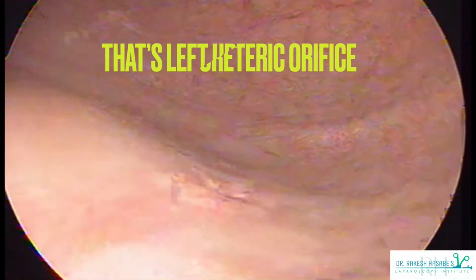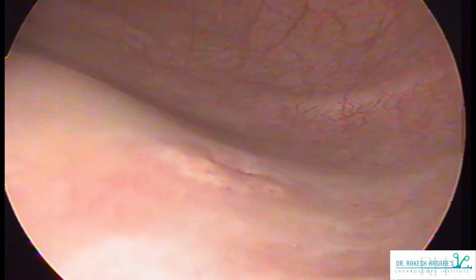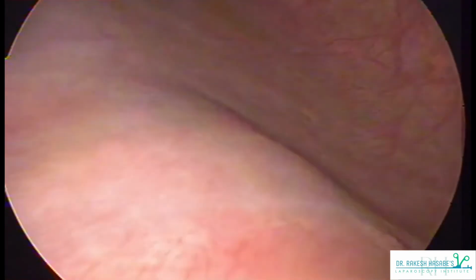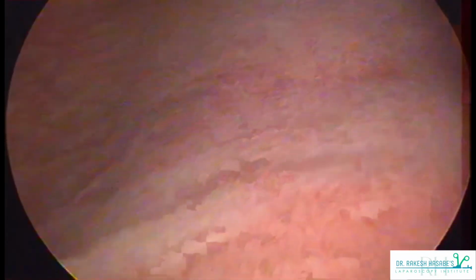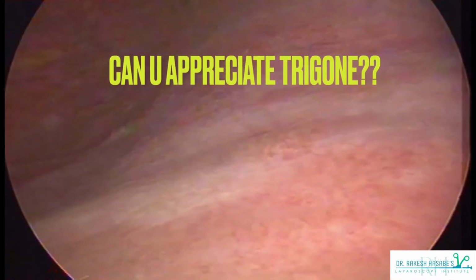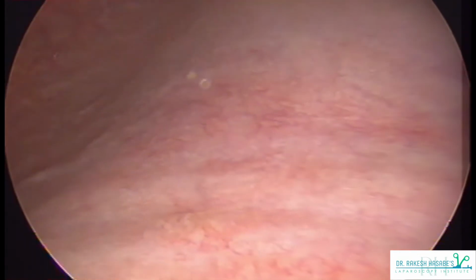So as you can see, I have traced the left ureteric orifice as well. The technique here is to follow the interureteric ridge, which will guide you from one ureteric orifice to the other. So let's come back to the left ureteric orifice again so that you get a good view or idea about the interureteric ridge.